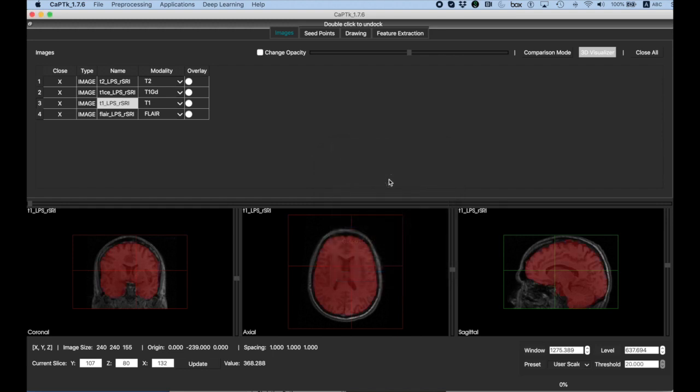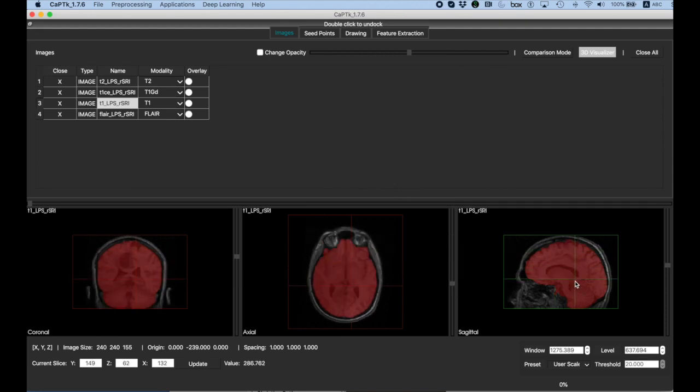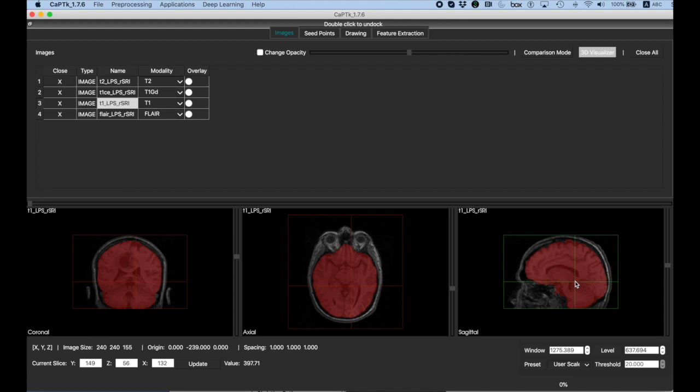Here are the results of the segmentation in red. We can look at slice by slice, and it looks pretty good to me. And for the actual deep learning, we use DeepMedic, which is an architecture developed by researchers at Imperial College London and is publicly available. References will be at the end.